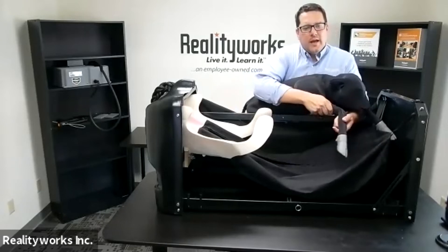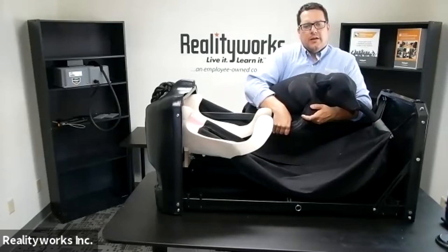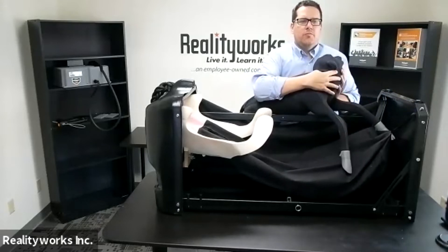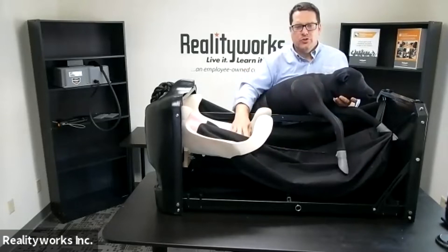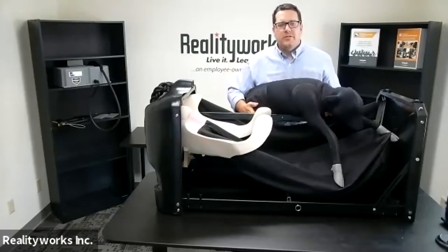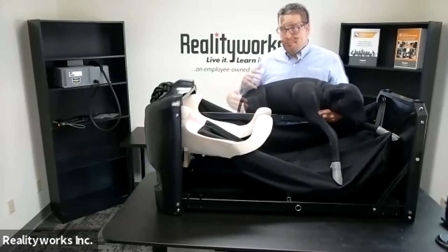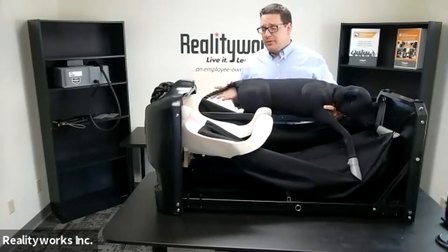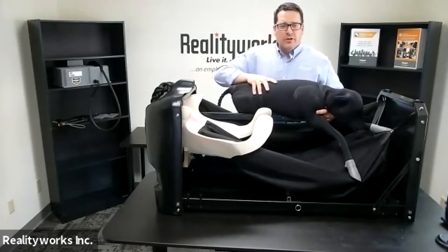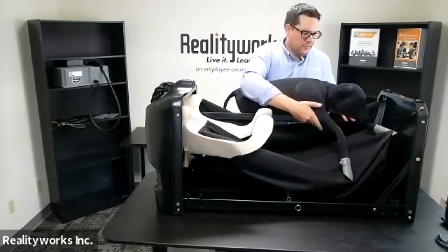The calf has different joint-like movements for realism — you can bend a leg and move it, and the head moves from side to side and back. Depending on how you place it in, you can do different birthing presentations. There are really 11 different presentations you can put it in for students to practice. The tail feature also helps students understand — if they pull on it incorrectly, you can show them how to do it correctly.